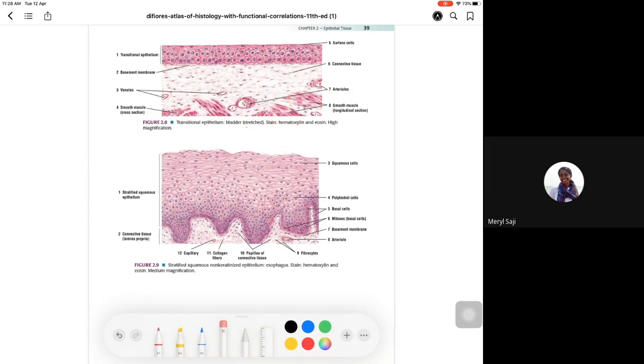And another applied point, there is some smooth muscle from the muscularis mucosa, and there are some muscles in the blood vessels, isn't it? How will you differentiate this muscle from the muscularis propria? There is an IHC named smoothelin, SMOOTHELIN. When that IHC is positive, that is in the muscularis propria.